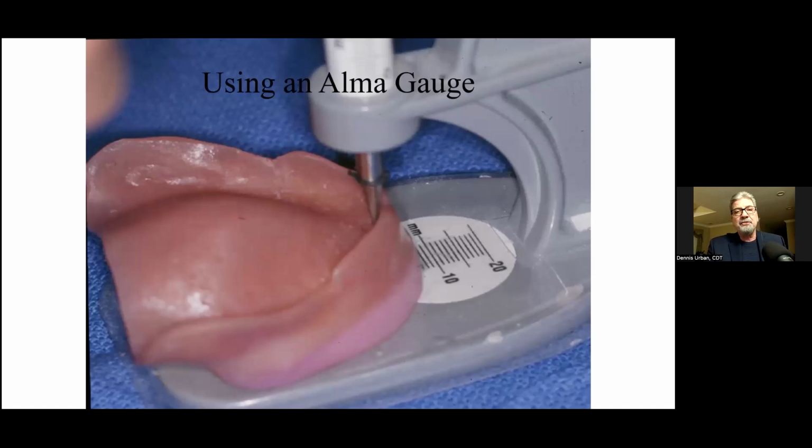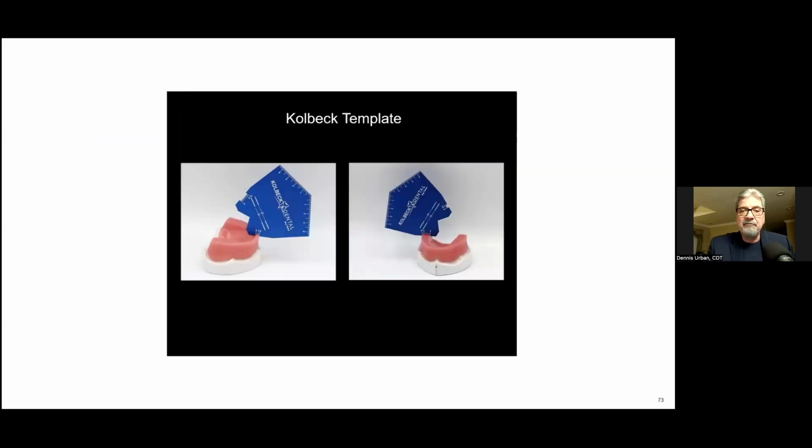And there's a couple of tools we use. One of them is an Alma gauge, and as you can see here, the pin is put into the papilla of this Alma gauge, and we're coming out on an average about 8 to 10 millimeters from the papilla when we're setting our anterior teeth. So this is a great guide, not only for bite rims and occlusal rims, also for denture setups.